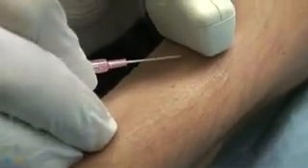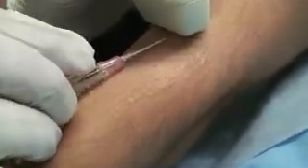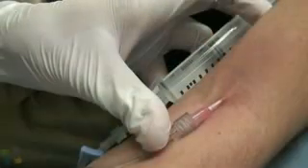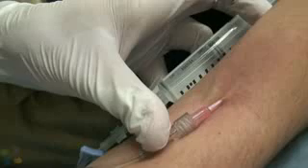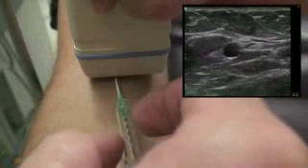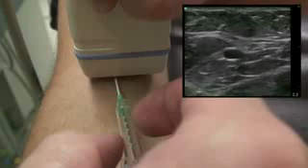After the flash is seen, advance the needle 1 to 2 millimeters further, then advance the catheter over the needle. Draw blood, flush and secure the line as with any peripheral IV. Be sure to wipe the site dry of ultrasound gel to facilitate securing the catheter in place. With minimal practice, ultrasound-guided IV placement can significantly improve your success in patients with difficult access.